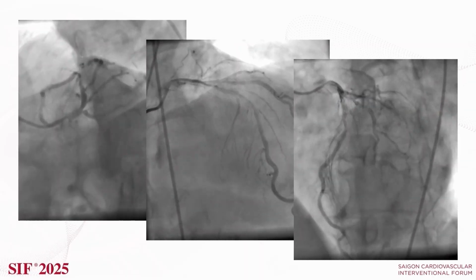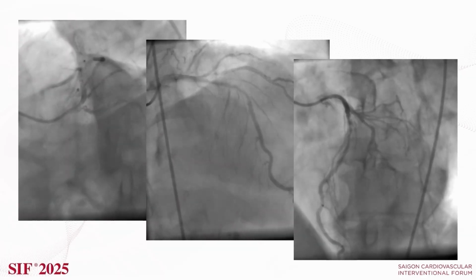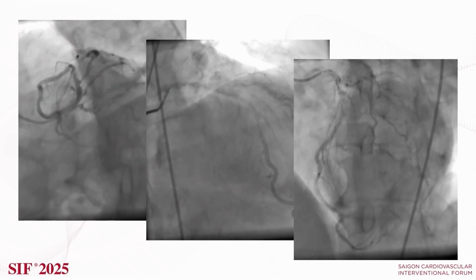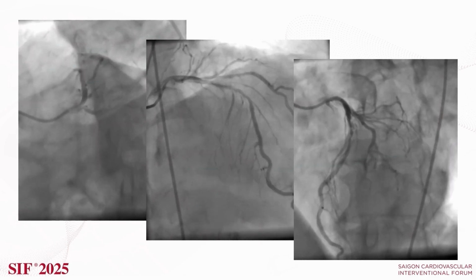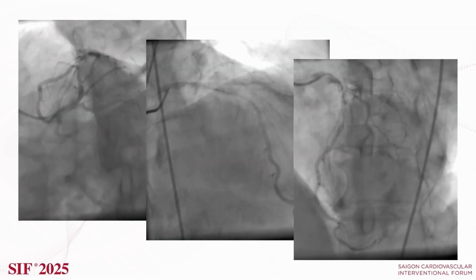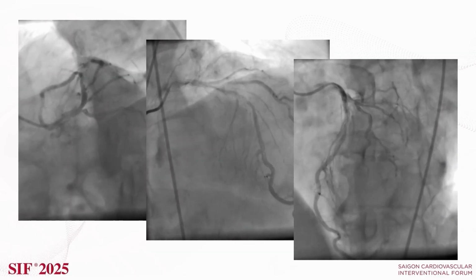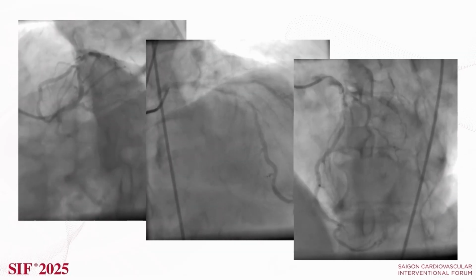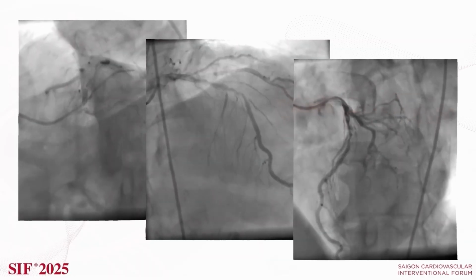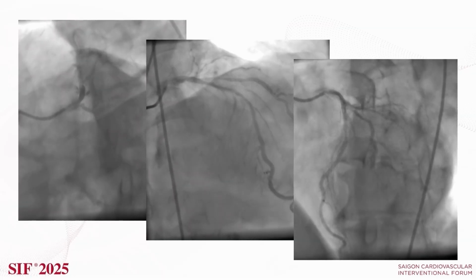So I would probably protect with the wire and then decide whether there's anything that needs to be done after the stenting of the left main. The only question is how do you want to make it easy? Because if you want to end towards the end, and there is a bifurcation diagonal and also the circ, then you may be dealing with 2 lesions and 2 bifurcations, and sometimes that can be difficult, and therefore you need to really think about how you're going to do this.